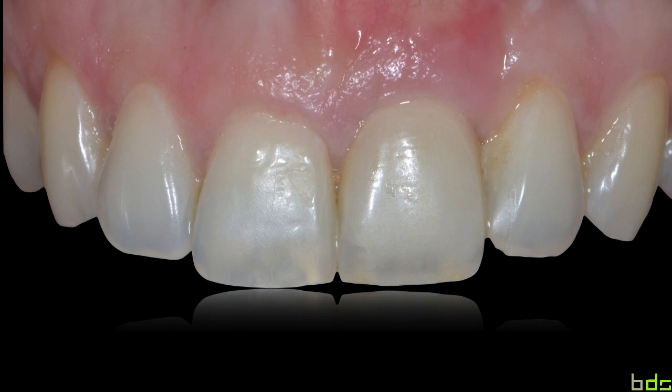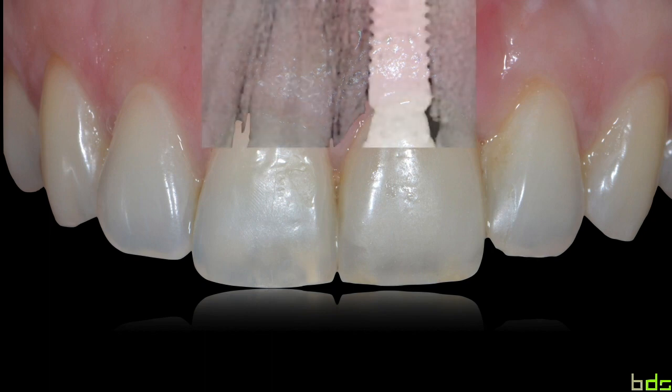Another case that was very nicely completed with beautiful respect of the pink and the white aesthetic scores. It's also hard to tell which one is an implant. The radiograph shows us that this is a left central incisor, this is the implant. Yet again, we go back to the same question. Is it the implant itself, here in that case, a bone level Straumann, or all the other factors that we respected properly?